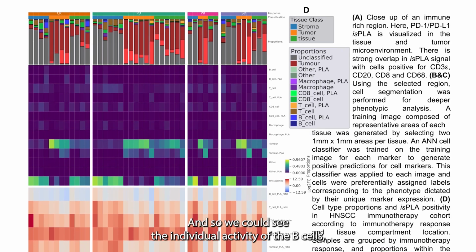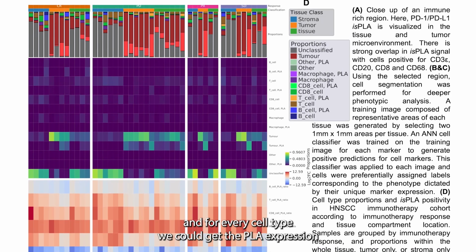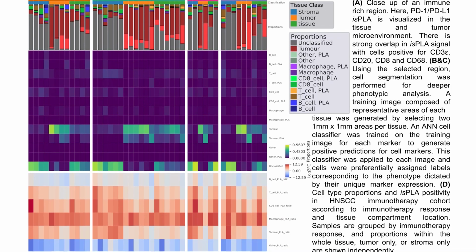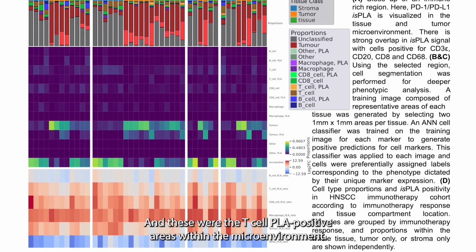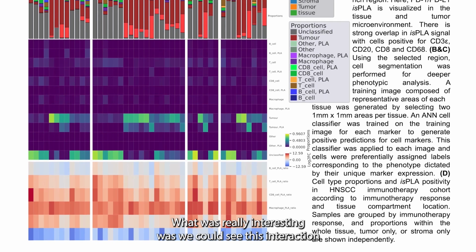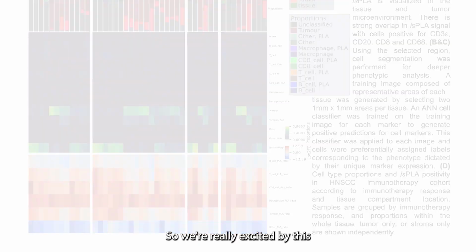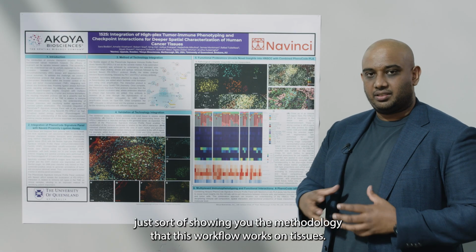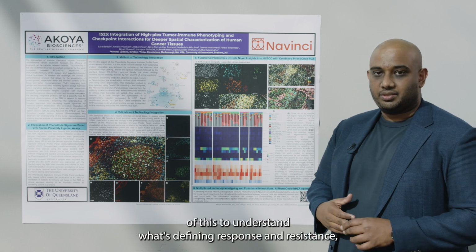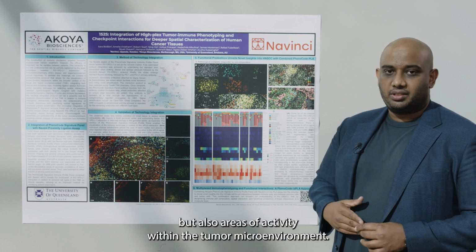And so we could see the individual activity of the B cells, the T cells, the CD8s, and for every cell type, we could get the PLA expression profiles at the macrophages, the tumor cells, and so on. We could see the B cell zones light up here, and these were the T cell PLA positive areas within the microenvironment. What was really interesting was we could see this interaction as an additive function of what we were looking at. So we're really excited by this. This is showing you the methodology that this workflow works on tissues. And so we will do deeper spatial analysis of this to understand what's defining response and resistance, but also areas of activity within the tumor microenvironment.